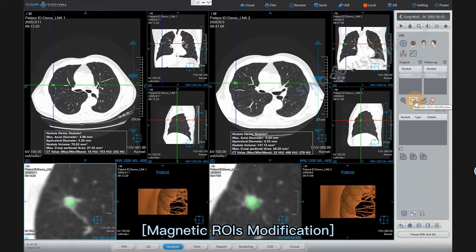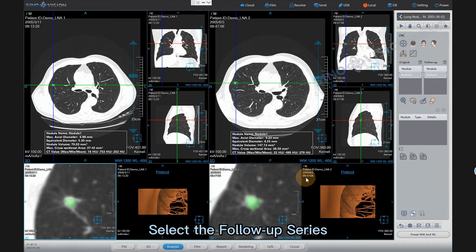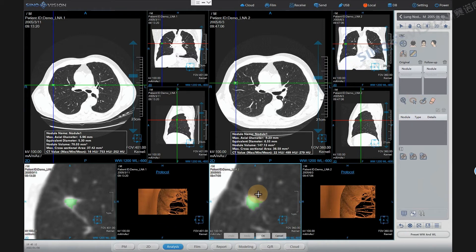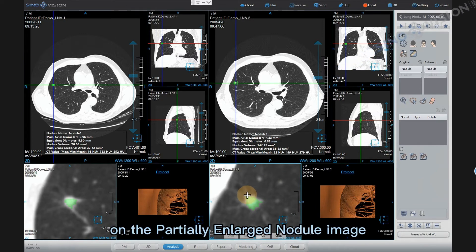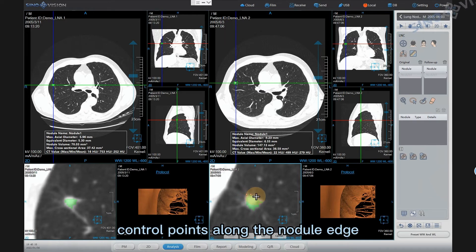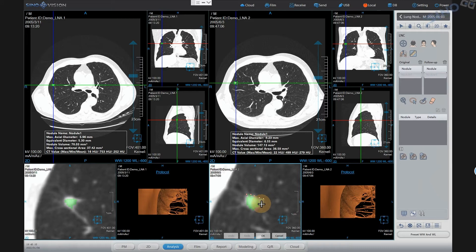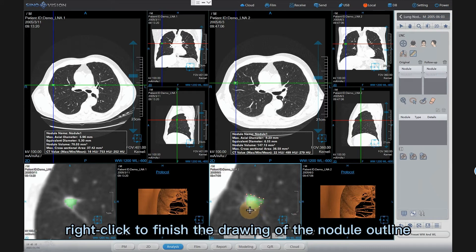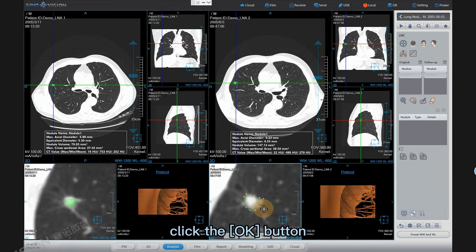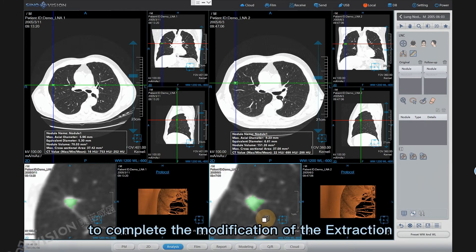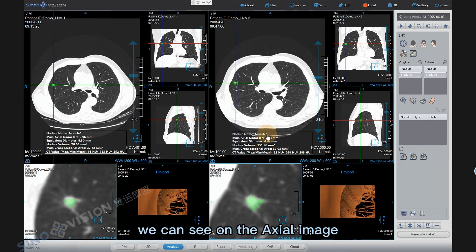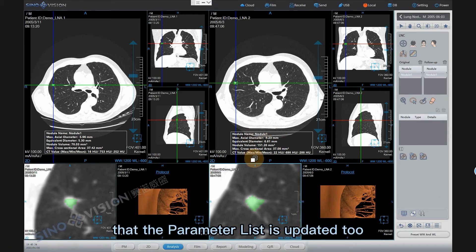Magnetic ROIS modification: Select the follow-up series, then click the Magnetic ROIS modification icon. On the partially enlarged nodule image, left-click to place control points along the nodule edge. Right-click to finish drawing the nodule outline. Click the OK button to complete the modification of the extraction. On the axial image, the parameter list is updated too.